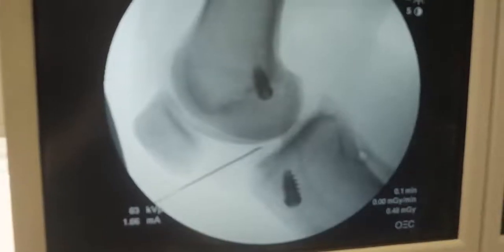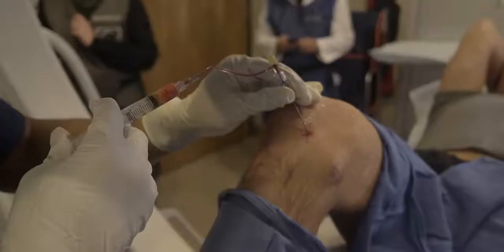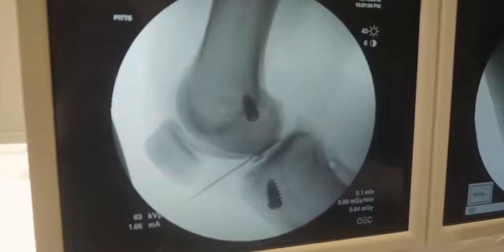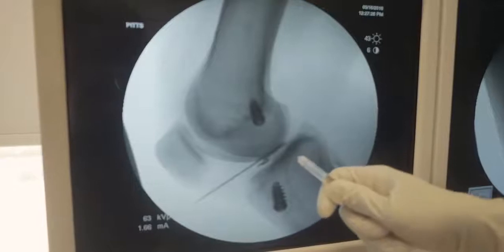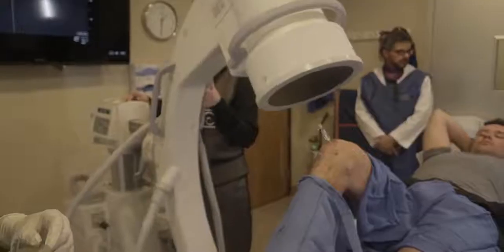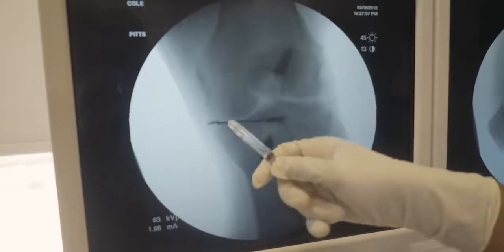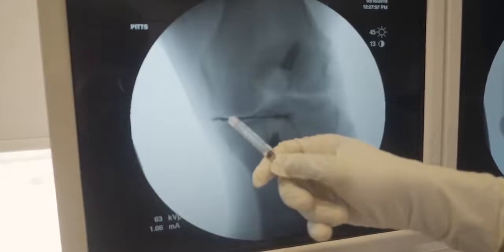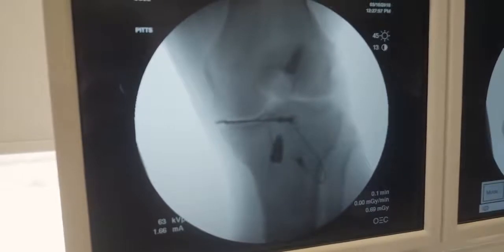We'll get a little bit more towards the inner side. We can see our needle heading right towards our target — we just want everything to be perfect. We're avoiding hitting the bone where the cartilage is, so as not to cause any cartilage damage. We're injecting contrast to see if it flows along this medial or inside part of the knee, right on top of the meniscus where our target is. We'll verify that it looks correct in another view as well. This meniscus is extruded out a bit to the outside, so I targeted my needle there. We can see contrast directly where the meniscus is — the outside portion as well as it flowing along the inside portion.